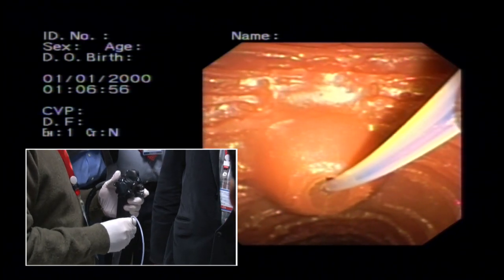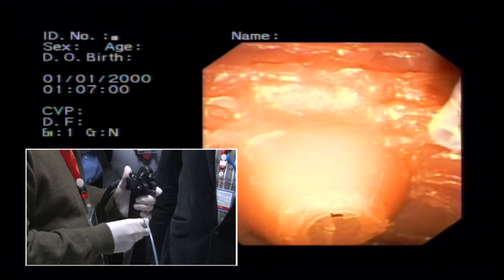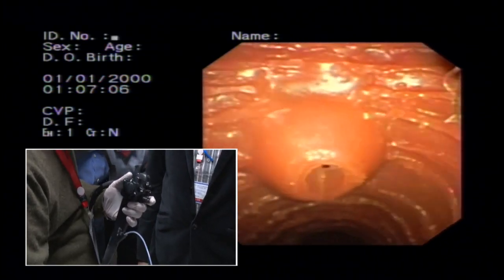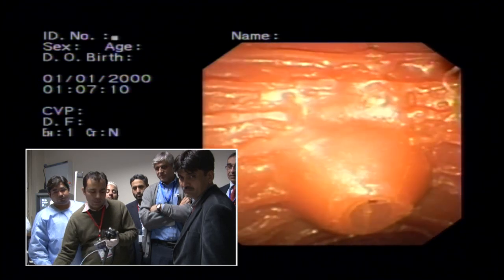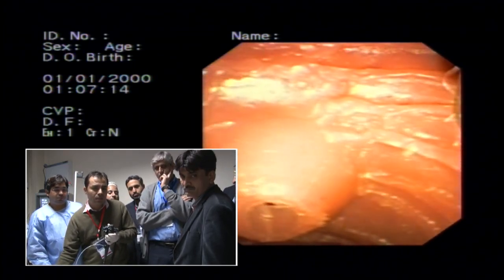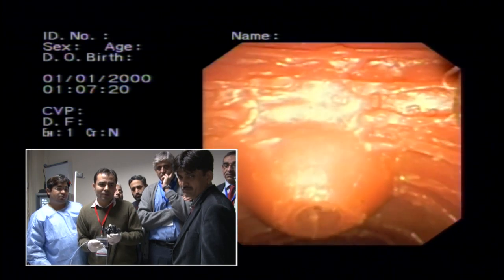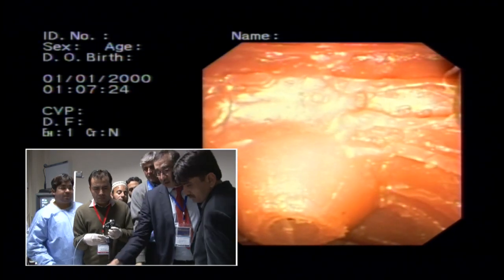Do you think your scope position is good? Not for stenting, absolutely not, and even otherwise. यहाँ पे तो ठीक है, प्लास्टिक है. हाँ, ये तो थोड़ा सा. What are you going to do? So, what options do you have? So just discuss. I think that's very important. I can use big wheel as well as I can pull back. Pull back. Yeah. ठीक है. So which one did you do? Both. Not both. इसको थोड़ा सा उठा ले, what gist of it.